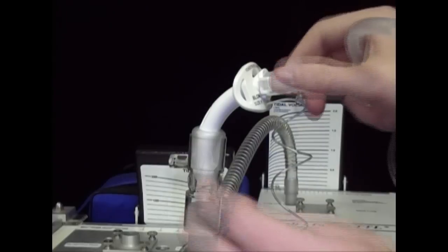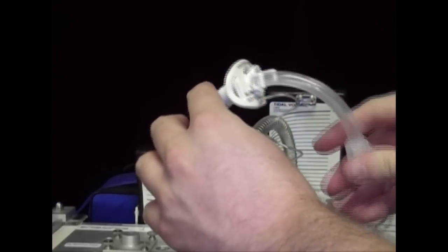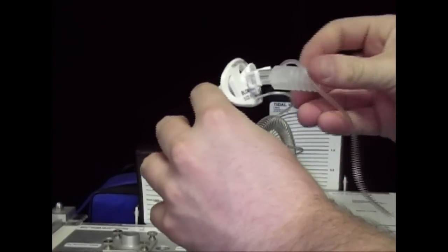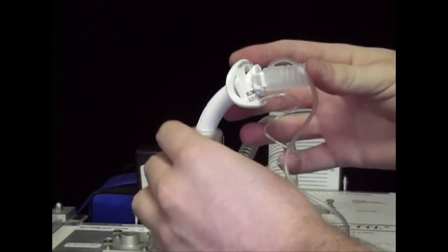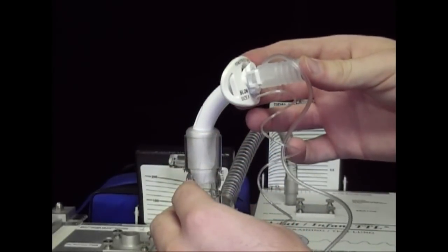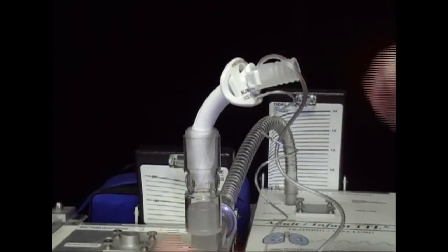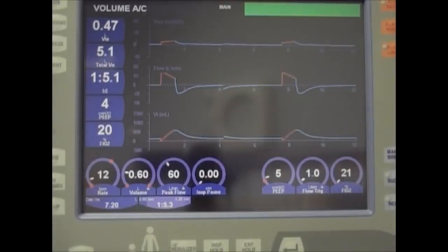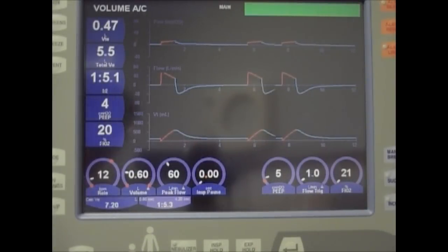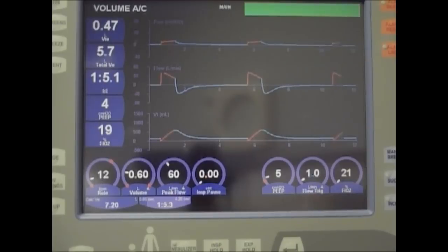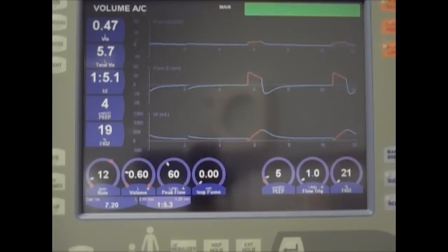Insertion of the subglottic suctioning cannula. You will now hear an audible click indicating the cannula is now secured to the Blum outer cannula. Now we are using the Blum subglottic suctioning inner cannula. Our ventilator settings are the same: SIMV of 12, tidal volume of 600, and PEEP 5. And our peak pressures remain the same.